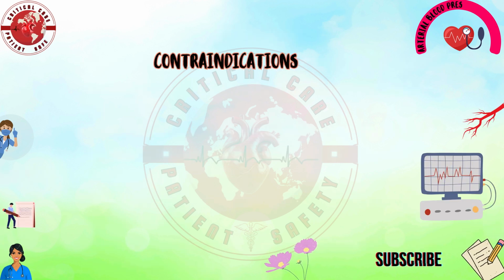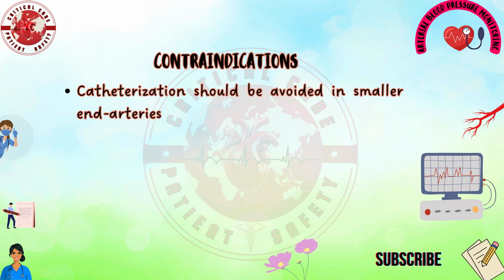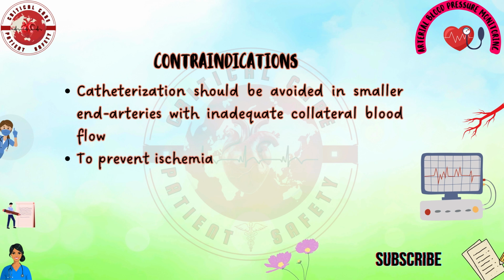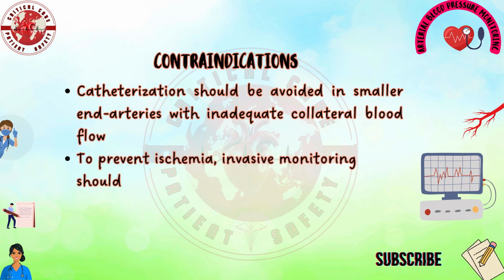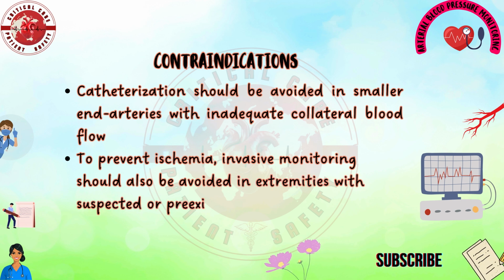Contraindications. Catheterization should be avoided in smaller end arteries with inadequate collateral blood flow. To prevent ischemia, invasive monitoring should also be avoided in extremities with suspected or pre-existing vascular insufficiency.